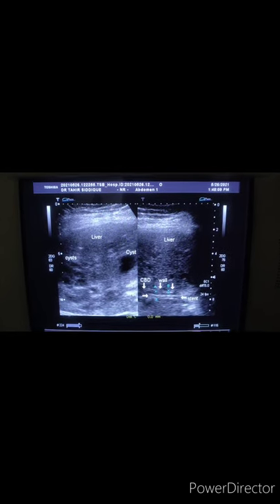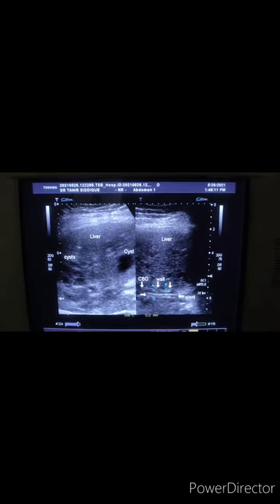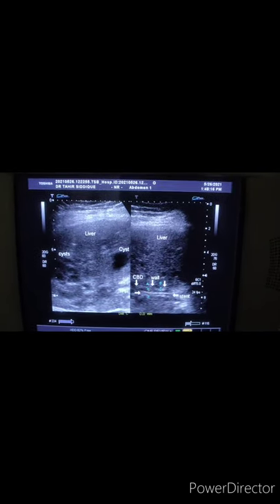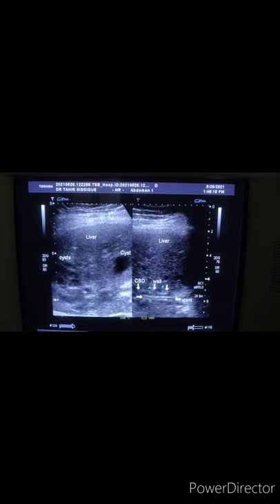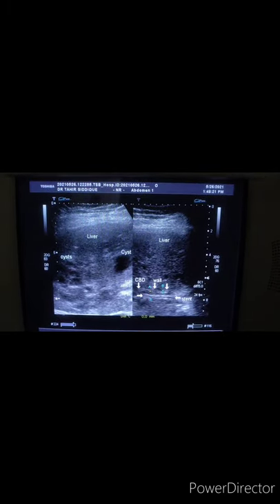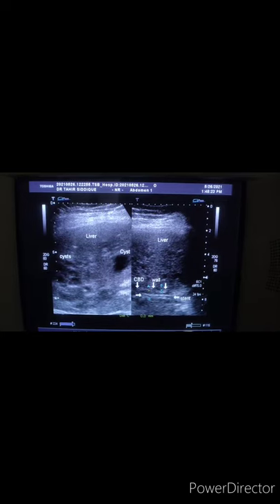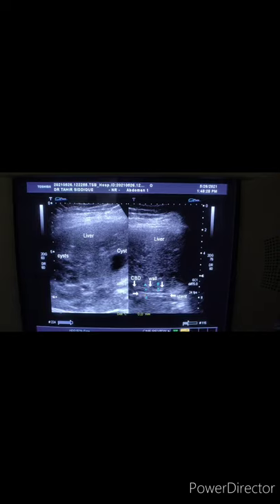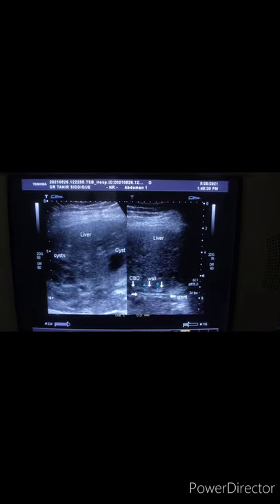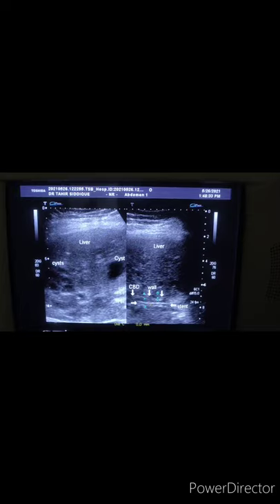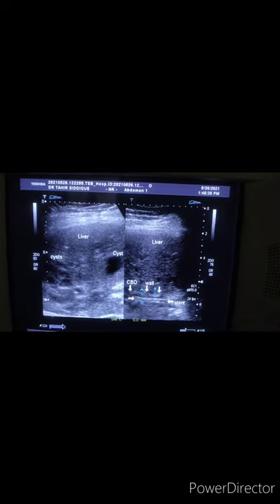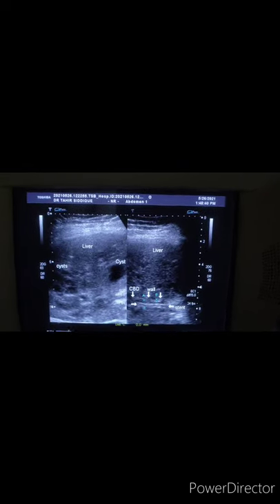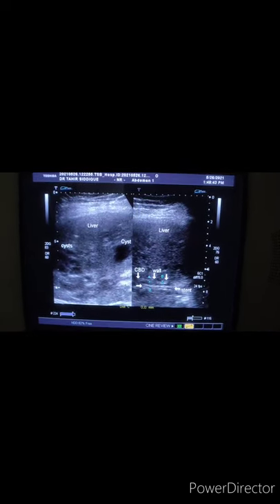This is the stent placed within the common bile duct, which is measuring approximately 7.5 mm. This is almost normal, as the gallbladder has been removed — without a gallbladder, up to 9 mm is taken as normal. So 7.5 mm is within normal limits. This is a tubular structure bounded by echogenic boundaries.